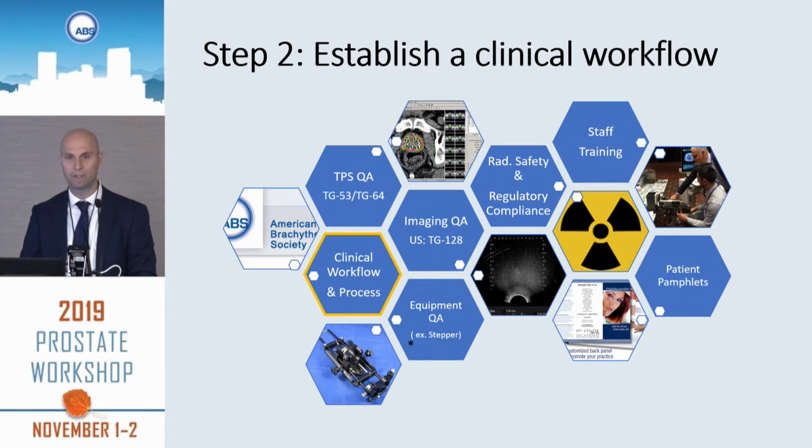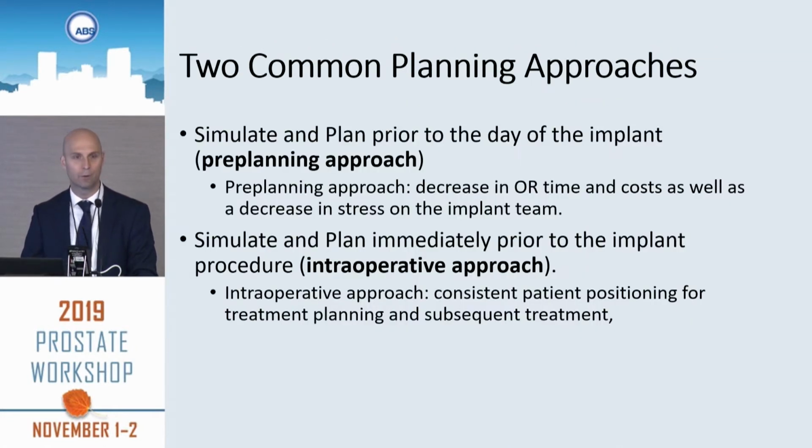Step 2 is going to be establish your clinical workflow. In general, there are 2 planning approaches. What we call the pre-plan approach, where you simulate and plan prior to the day of implant, and I feel like that has advantages in decreased OR time and costs, as well as a decrease in stress on the implant team, just one less thing you have to worry about on the day of implant.